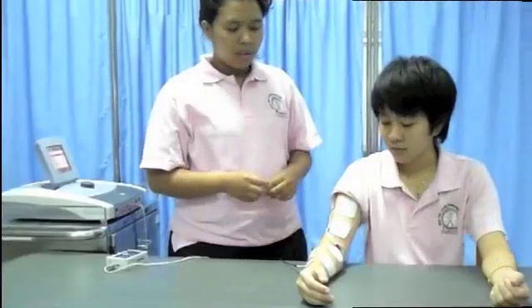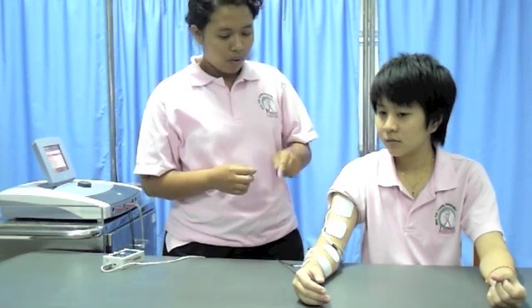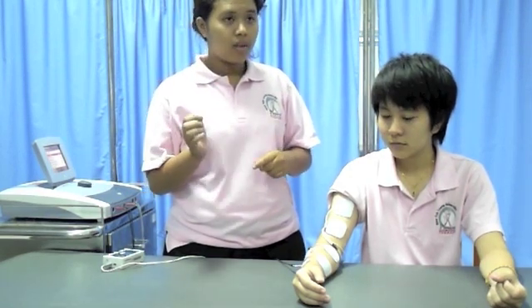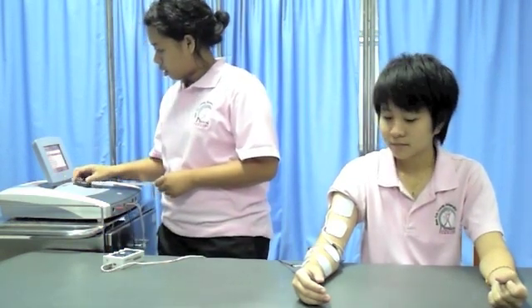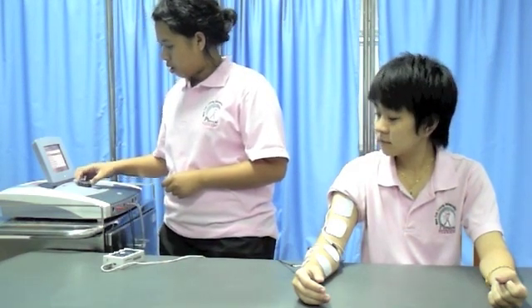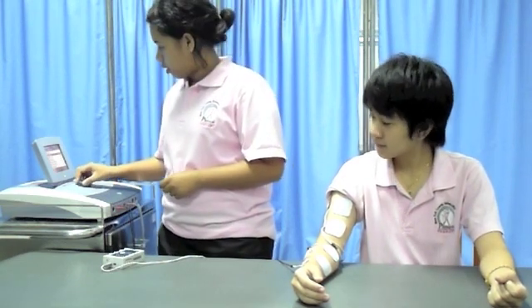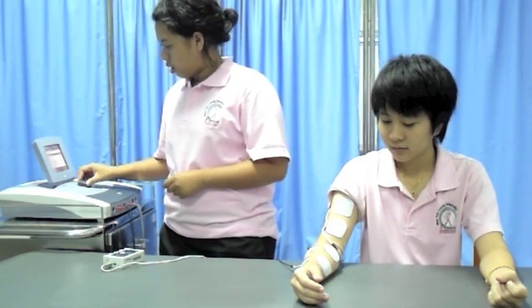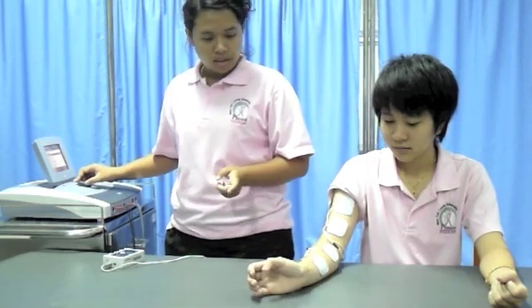I will increase the intensity of the first channel on the extensor movement of your forearm. Its action is extension. Do you feel the current? Yes. This is extension.